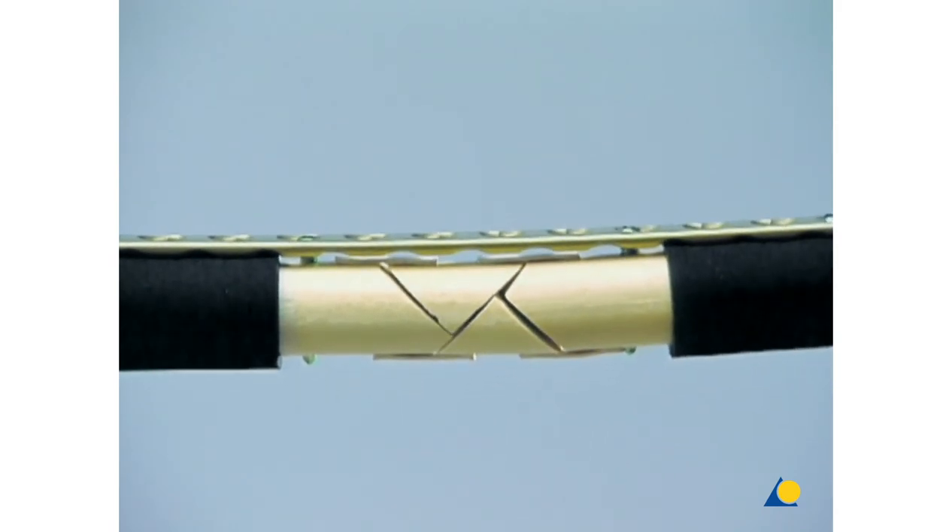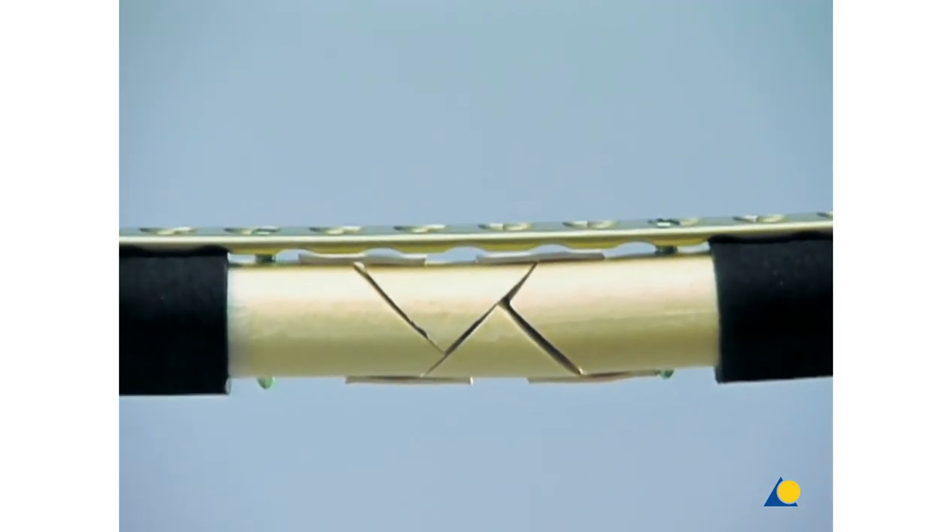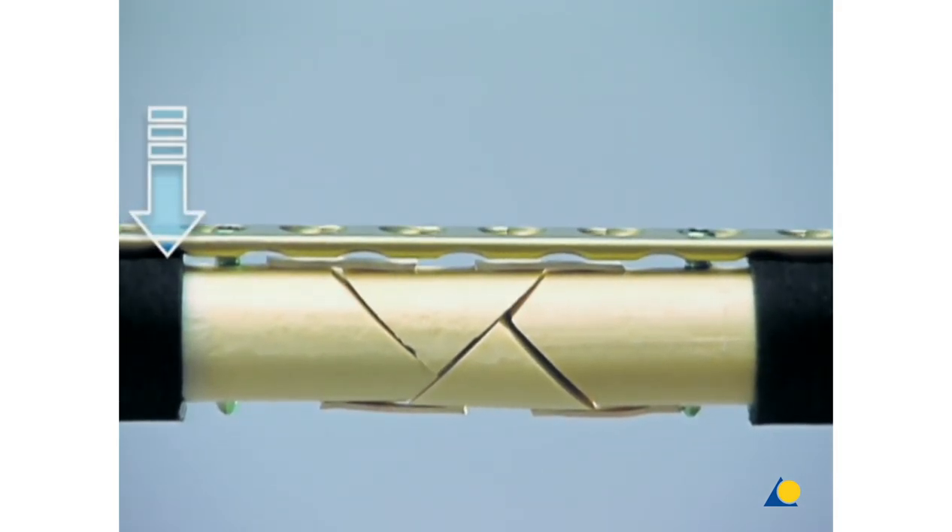Removing the outer foam layer shows that relative stability is achieved with no compression of the plate on the bone and no inter-fragmentary fracture compression. The fracture area has been bridged by the plate.